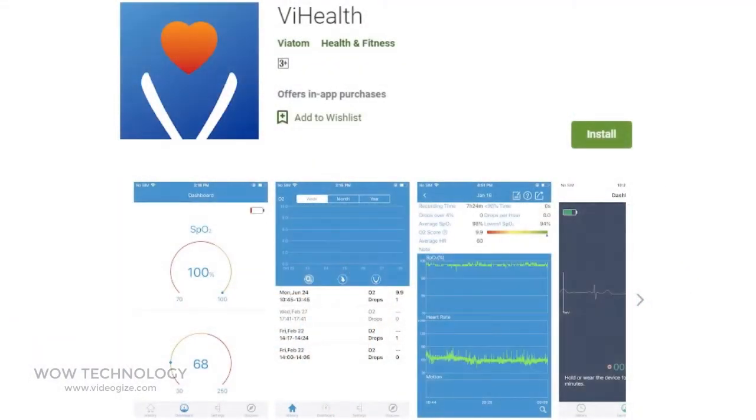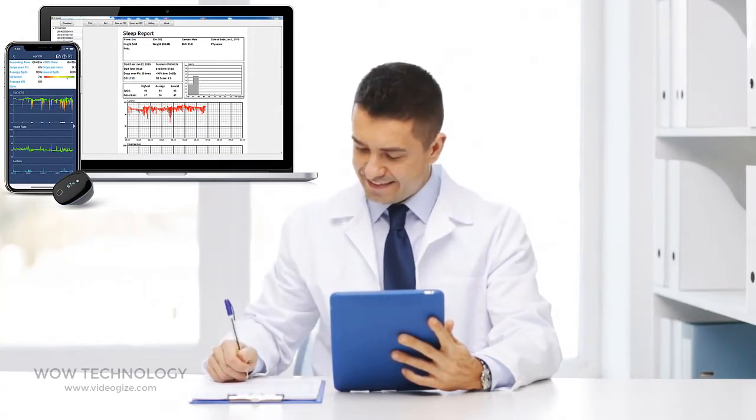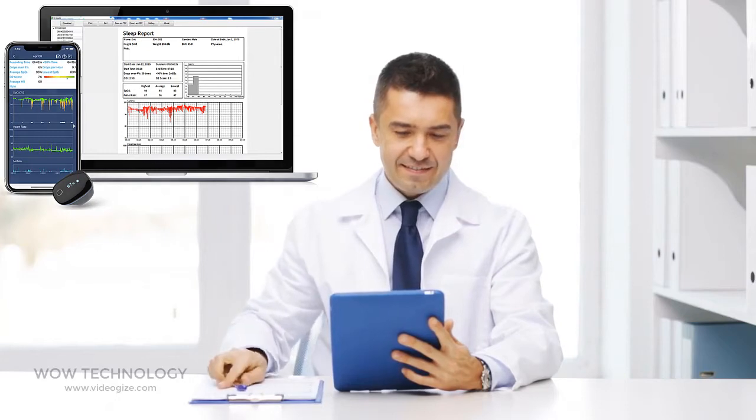You can monitor more details via the app. Just go to the App Store and install the ViHealth app, offering both real-time displays as well as downloadable detailed reports of nightly, weekly or long-term sleep data, which you can download and share with your doctor.